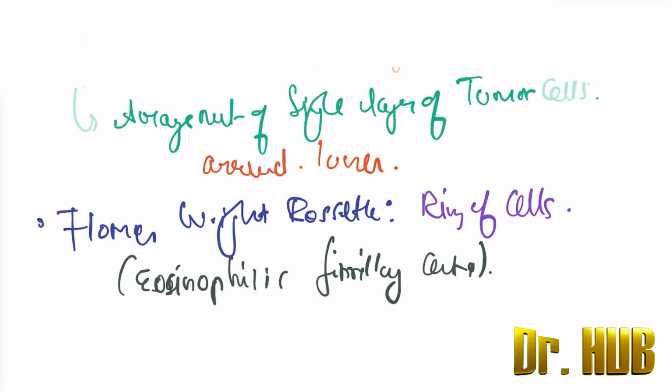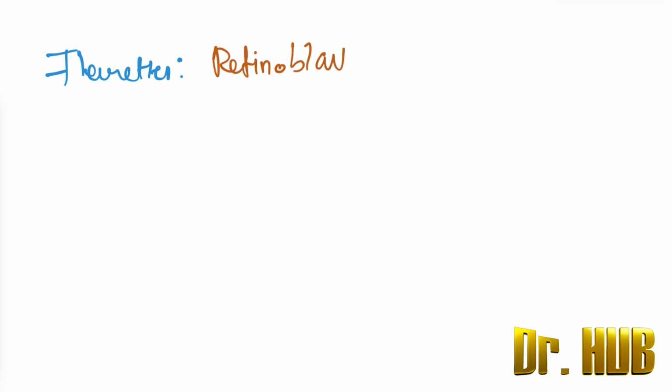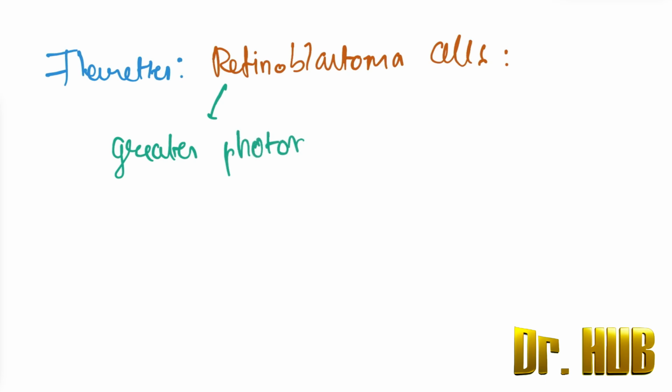Then there is also the presence of fleurettes. These are retinoblastoma cells that have undergone photoreceptor differentiation and group together as a bouquet.